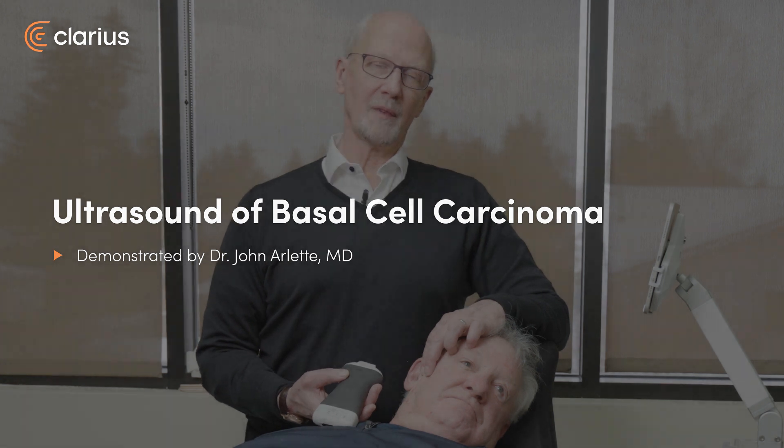We're using our L20HT3 for dermatology purposes. We're examining a patient who has had a number of skin cancers and is presenting with some new lesions.